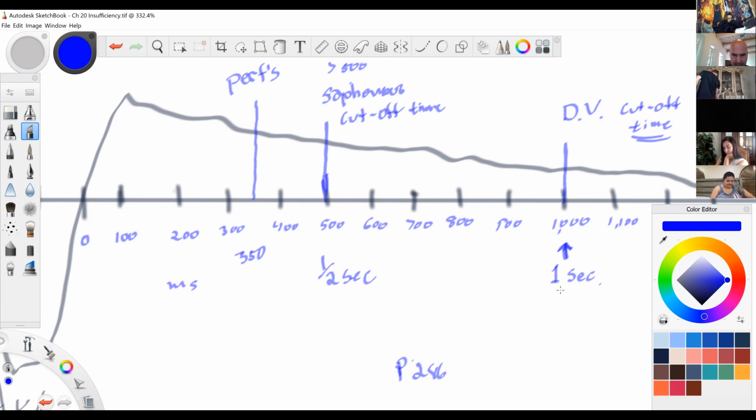I've got the page. All right, I don't know where it is. We talk about it soon enough, with arterial exams, the lower extremity arteries. We do plethysmography. Sometimes it's the same exact equipment, but a little bit different in how it's used.